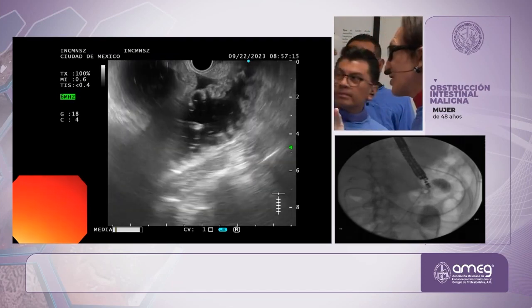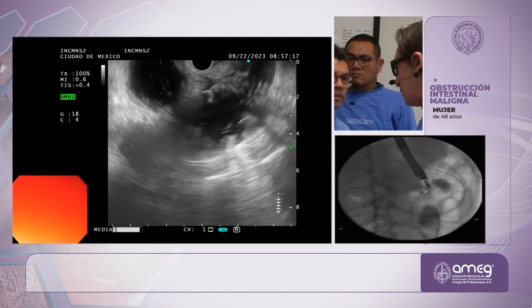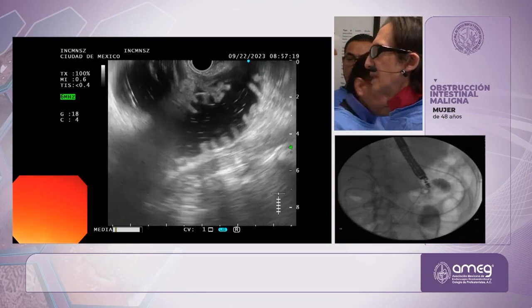All right, so let's get the axios ready to go, please. Okay. So if I can have the 20, yeah. Yeah, okay.